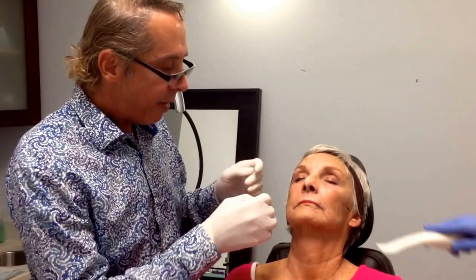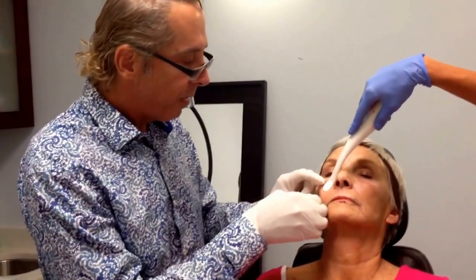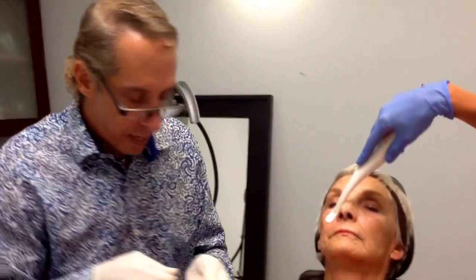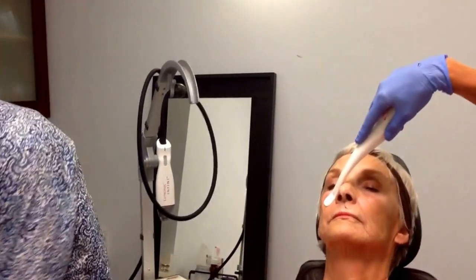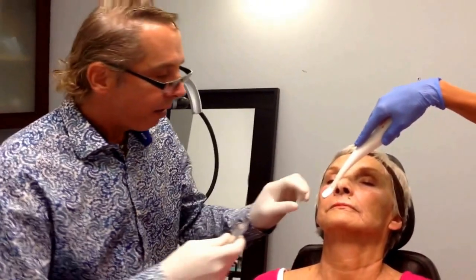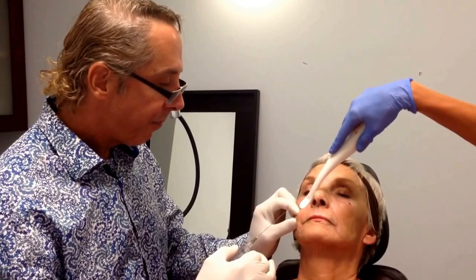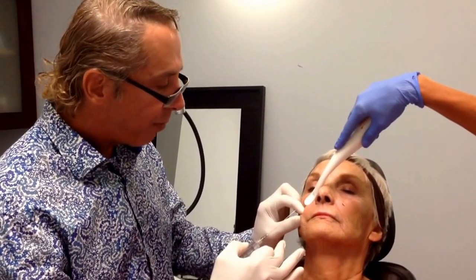I make an entry into the skin with this needle here. And then I come back in with a 22-gauge, 70-millimeter, blunt cannula. And this is from Softfil.